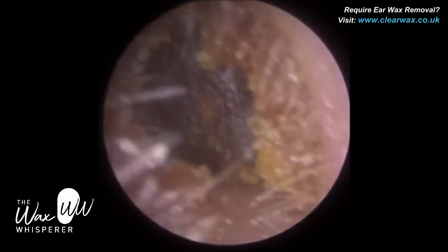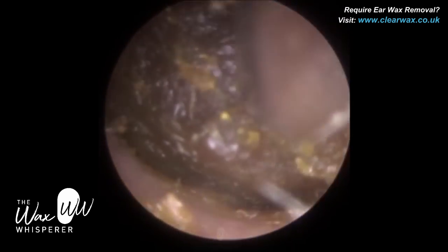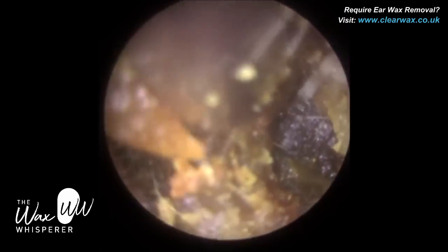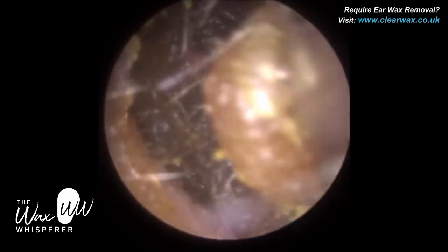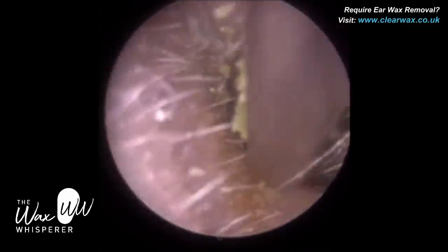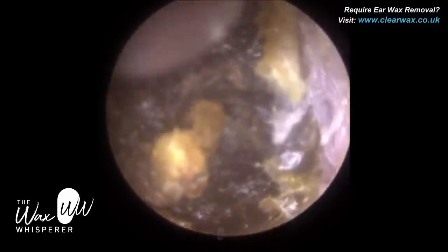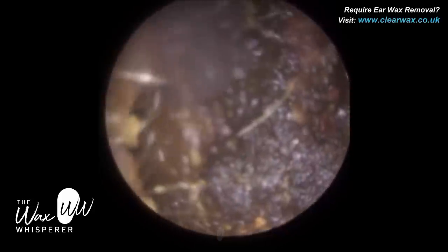The reason I stopped — whilst you're now watching the left ear, we've moved to the left ear and you'll see me similarly funneling through the wax. Again, we can't use drops with this patient because the patient is sensitive to drops — he's had reactions to olive oil-based, sodium bicarbonate-based, and hydrogen peroxide drops. On the right side I had to stop, although I'm happy with that. We cleared the occlusion, which is why the patient came. They could hear significantly better, but at that final stage clearing dead skin, they developed the caloric effect.